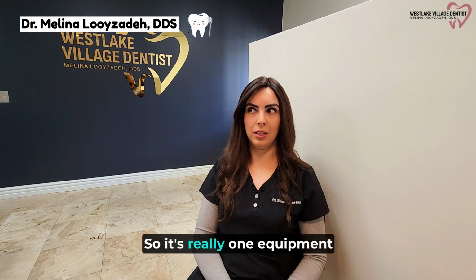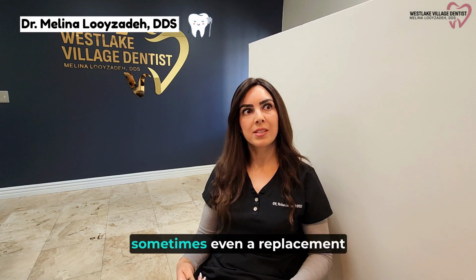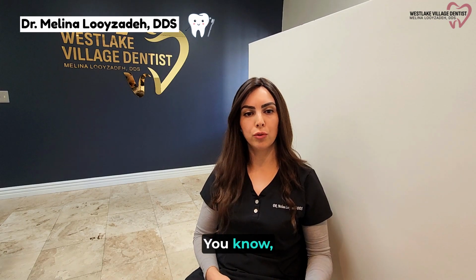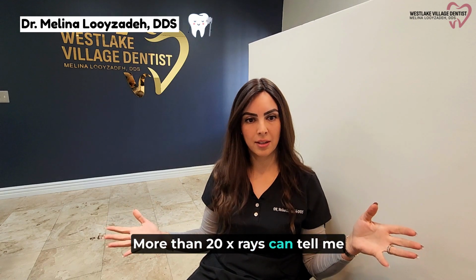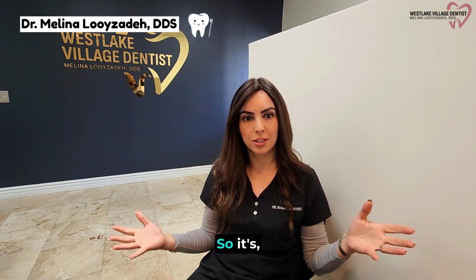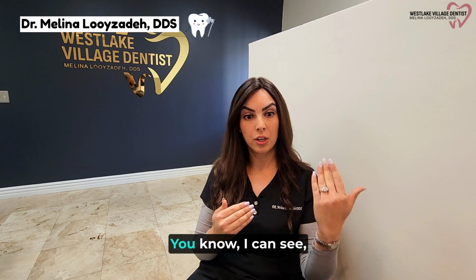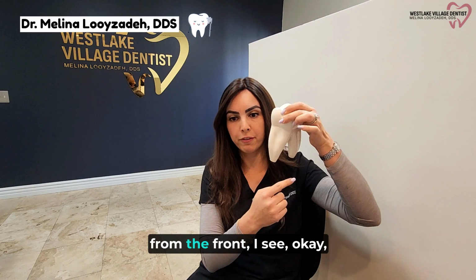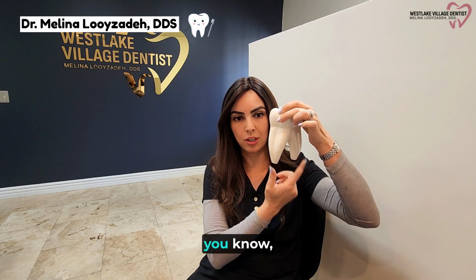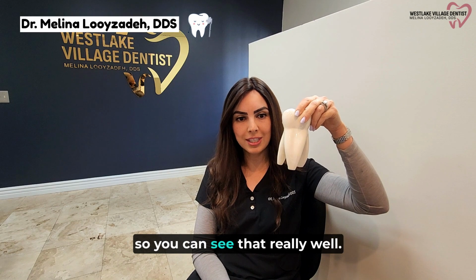So it's really one equipment that I absolutely love to use, and it's quickly becoming sometimes even a replacement for X-rays. One scan can tell me so much more than 20 X-rays can tell me at any moment. So I can move things and see it in sections. Let's say this is a tooth, and on an X-ray all I see is from the front. I see, okay, well, there are 2 roots in this, but really they're not. There are really 3 roots in this, so you can see that really well.